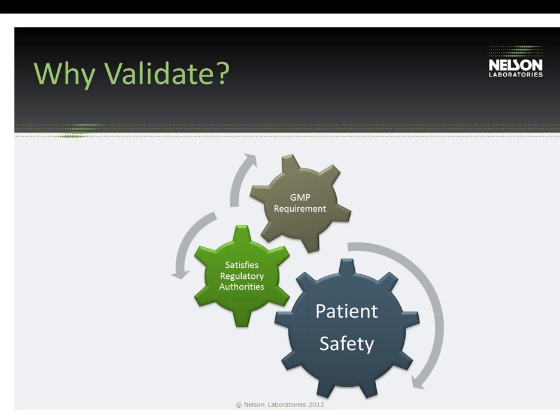And most importantly, a benefit of these cleaning validations is patient safety. There could be residues left behind on these devices that could be cytotoxic, which could be very harmful for patients if implanted.